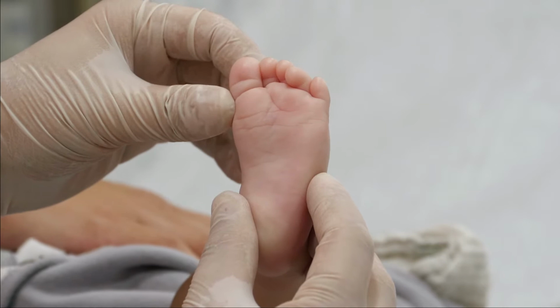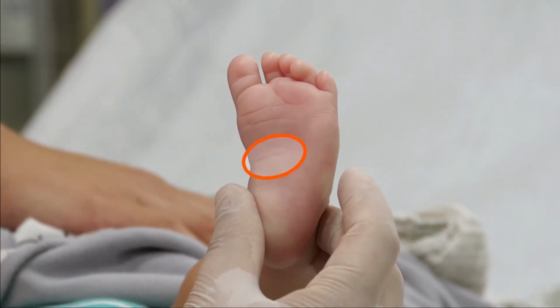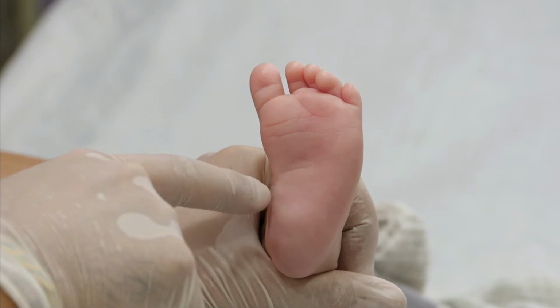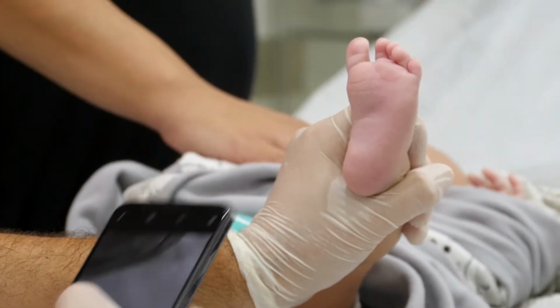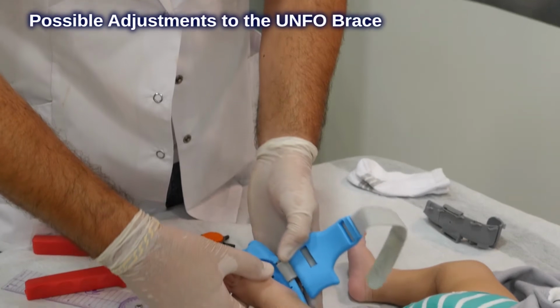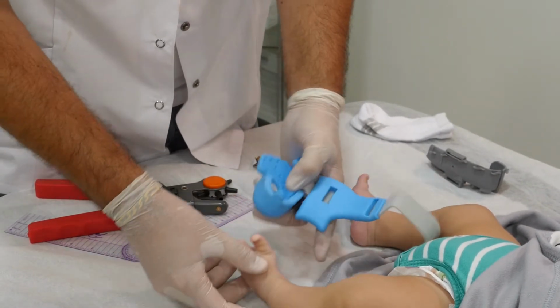The third examination checks the medial crease. If there's a medial crease, this is a parameter which indicates a situation where the foot won't go normal without medical intervention. Before starting the therapy, it is recommended to take a picture of the foot to monitor the therapy progress. You can make adjustments to the Unfo brace if needed, depending on the foot shape.